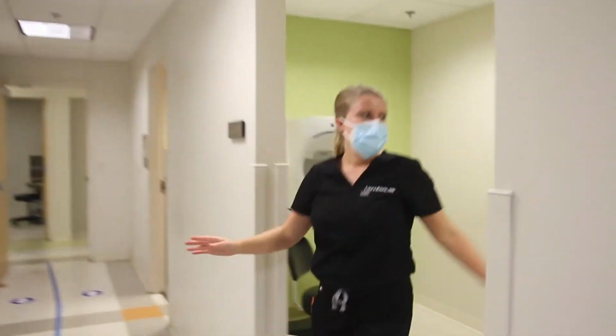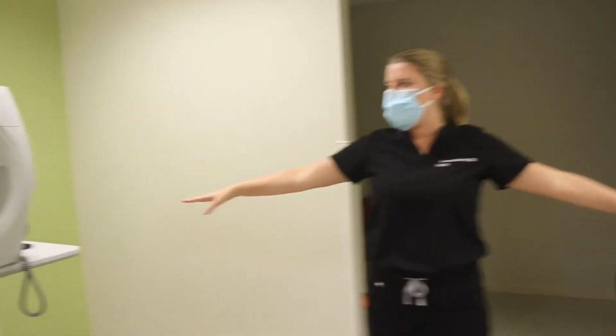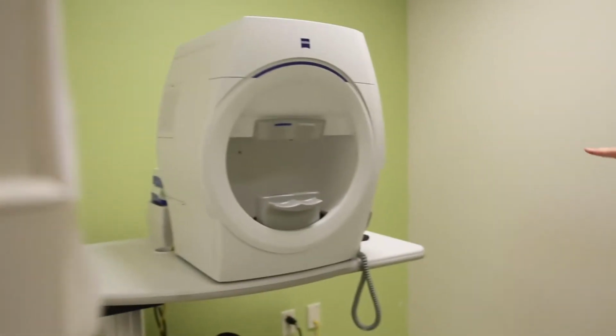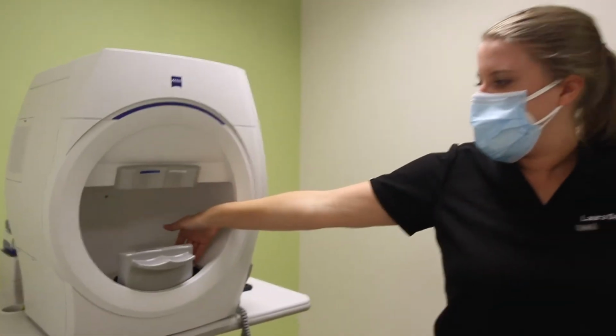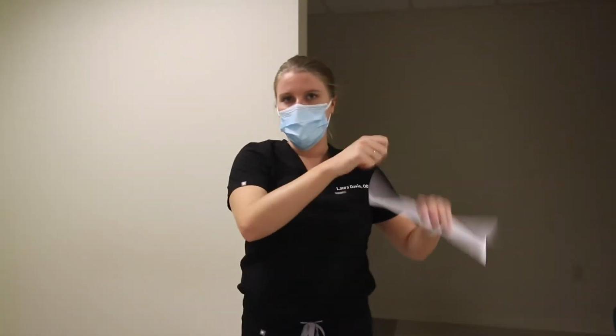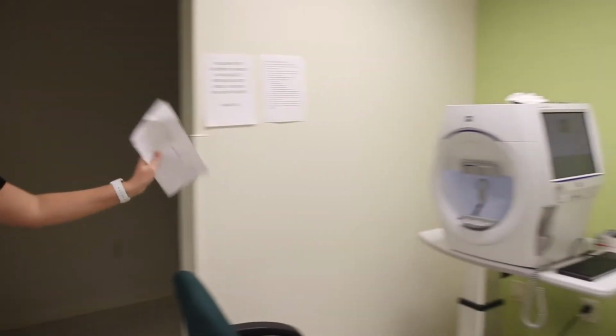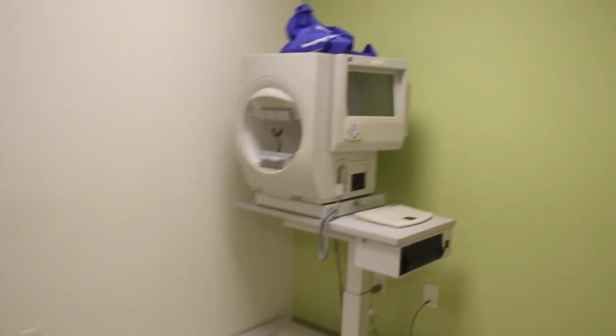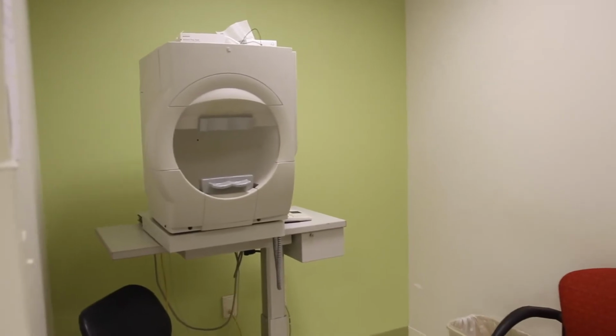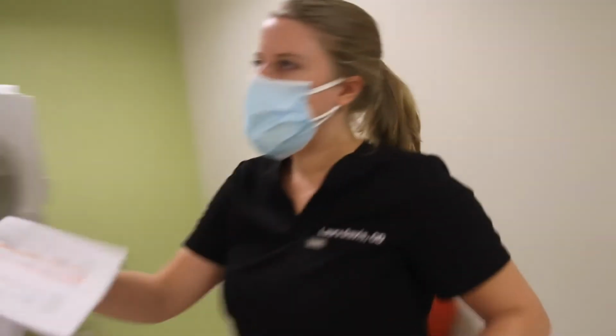We'll go down here. In this space, we have 2 more visual fields. These are actually brand new. They're new since I was a student here last year. We have the liquid lens in these, so you don't have to fumble with the lenses. It puts whatever prescription you want in, which is pretty sweet. And then we have 2 more in here, but again, these are the old ones. We haven't been using them too much since COVID. We're starting to ease back into it. But it's nice that we have 5 visual fields that we can use. All right, let's head back out.